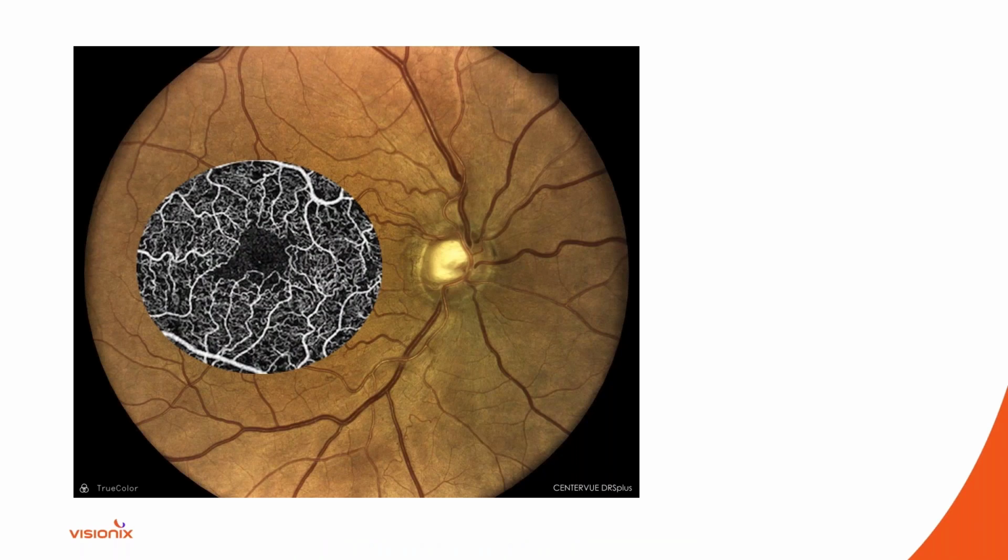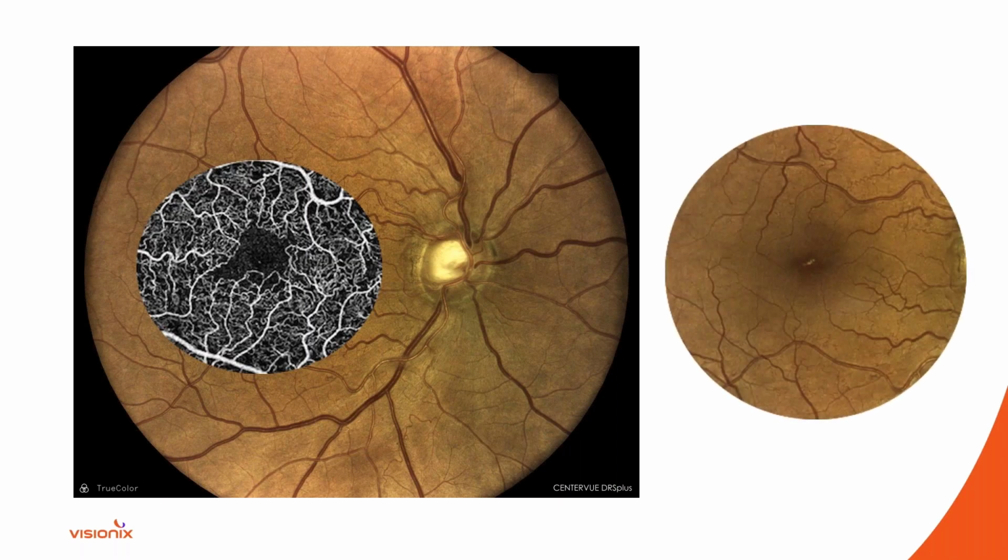And guess what? He's got a lot of problems. Okay, so he's got, again, pardon me, really generalized enlargement of the FAZ. He's got anomalous vasculature here that is kind of going into the FAZ. So just a lot of capillary looping, we call it. So not really the best image in a patient that really did not look that impressive without OCT angiography.